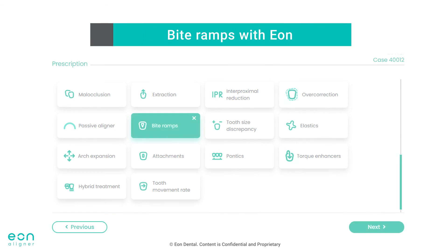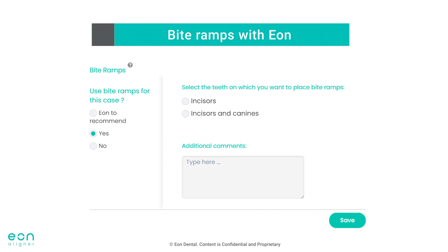With EON cases, you can specify your preferences for bite ramps from the prescription tab. You can either choose EON to recommend where bite ramps will be added according to the needs of the case by EON's treatment planning team. Or you can request to specifically add bite ramps on incisors, or on incisors and canines. The note box will allow you to add any special instructions such as the timing of bite ramp placement. Or you can choose no, and EON's treatment planning team will avoid placement of bite ramps for that specific case.